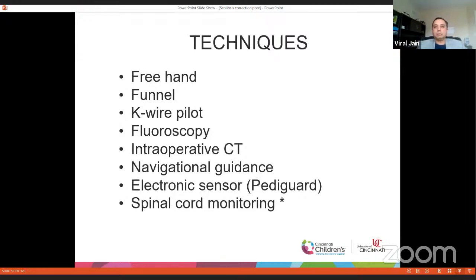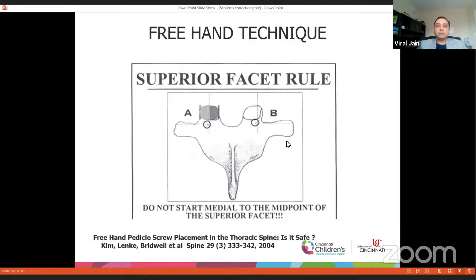We use the freehand technique, popularized by Lenke and his group. In the freehand technique, the primary landmark is the outer half of the superior articular process aligned with the superior border of the transverse process — their meeting point is where the pedicle usually is, slightly lateral and superior. You do not want to start in the medial half of the superior articular process. Several charts are available depending on level, but this rule holds true for almost all thoracic levels.